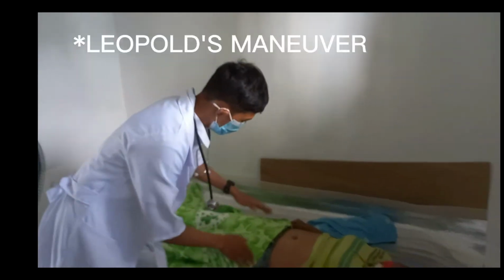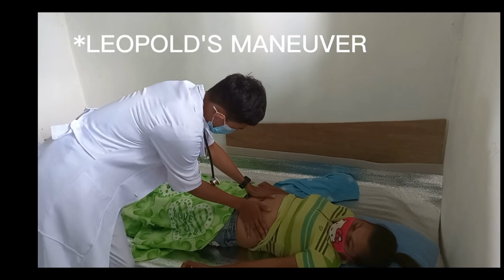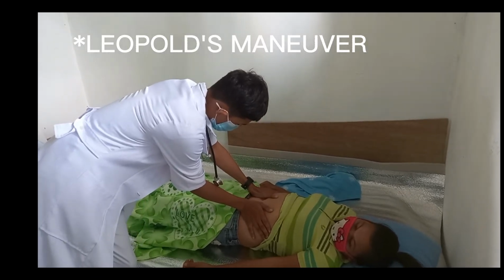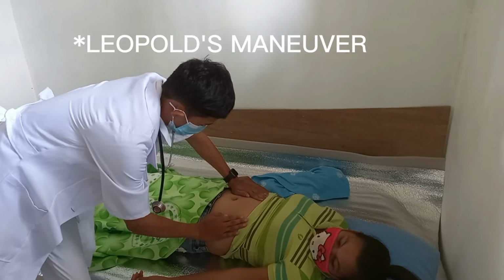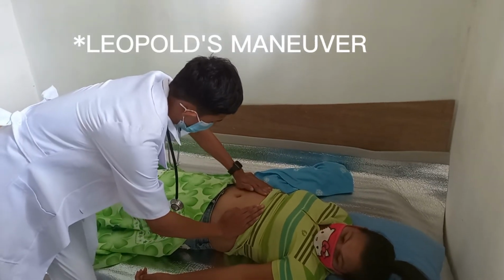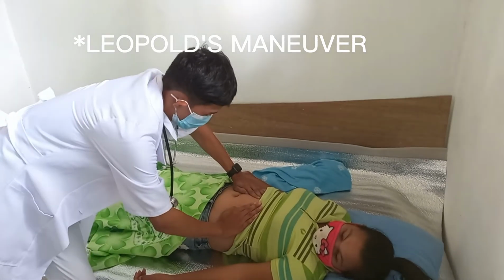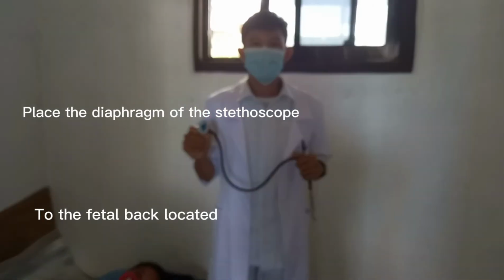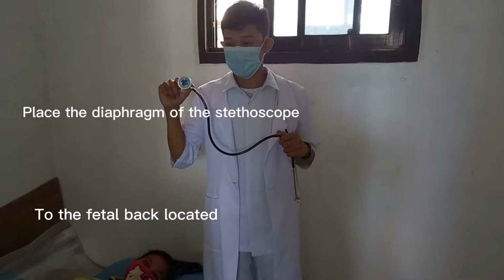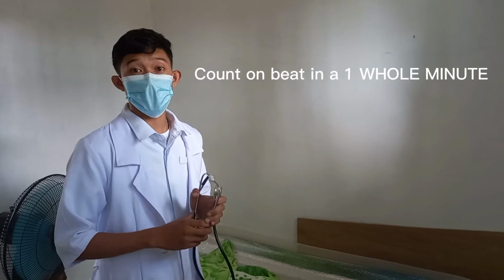And now, I will be performing the Leopold's maneuver. Next, I will place the diaphragm of the stethoscope on the located fetal back and count the beats for one whole minute.